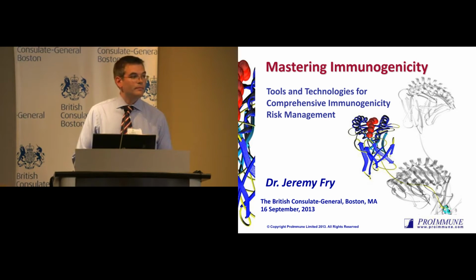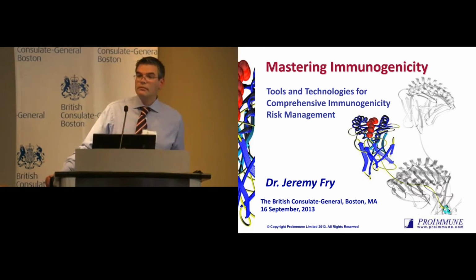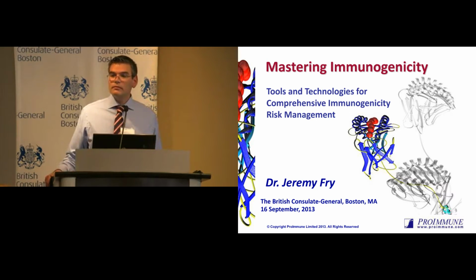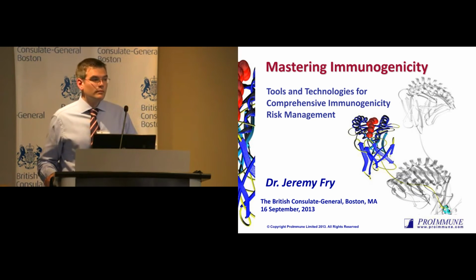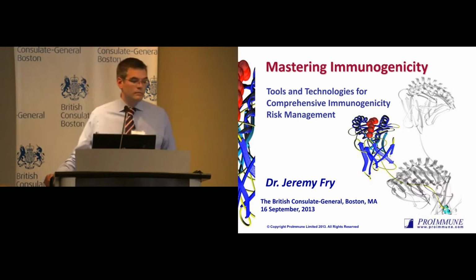Possibly we could get hold of it, but we decided not to develop the assay around it because we couldn't get hold of it consistently in the future as an assay control as a formulated drug. It's now owned by another organization, and I'm not sure they're really producing clinical batches. Roche have worked with the same assay and consistently get a positive response on that antibody.